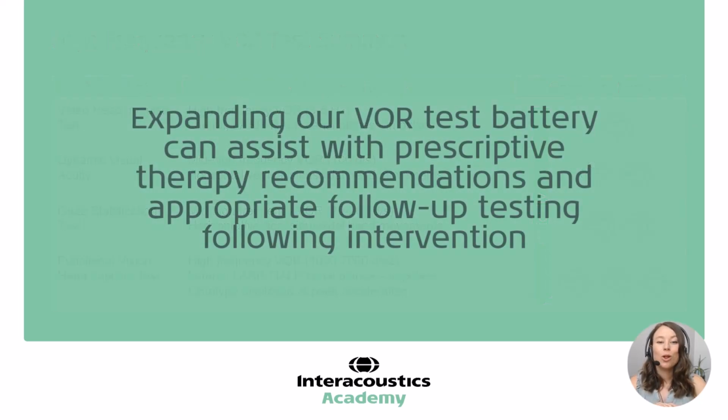In general, looking at these high frequency VOR tests, we know that when you've got more tests in your battery, that can really help simplify and personalize the therapy recommendations for that patient. And the choice of which test to do, DVA, GST, vHIT, fvHIT, really depends on your clinical judgment and the patient that's sitting before you and their complaints. Because depending on what they're complaining about, you may choose a different test sequence to identify where that patient is breaking down.